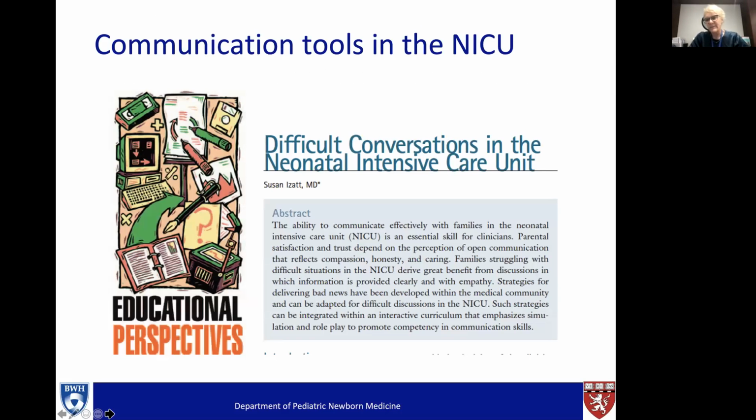Part of the other reason there's been delays in implementing MRI in the preterm infant, I still have to believe, is our difficulty as clinicians in having these conversations with families. If we don't look, we don't have to talk about it. And it really is challenging when a baby has come through a really tough, long course. Their parents are anxious, and then you're going to have the MRI scan and give them additional knowledge and information that you may not feel comfortable conveying to them when you've been the one reassuring them that all the cranial ultrasounds were negative, rather than the word I don't think should go with cranial ultrasound, which is normal.